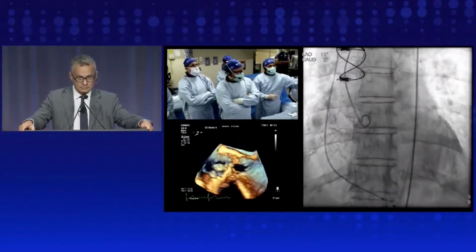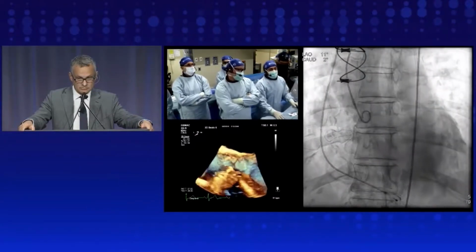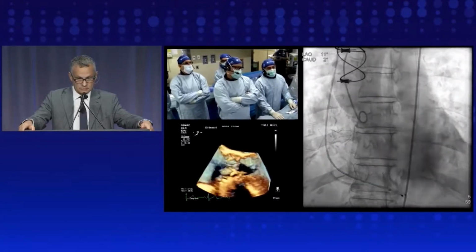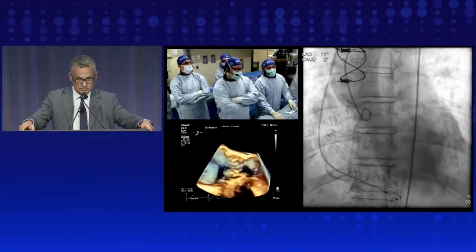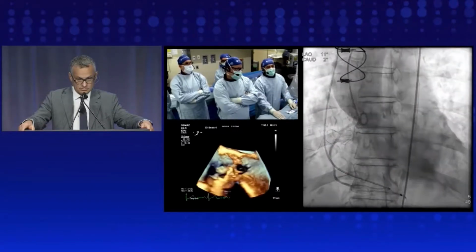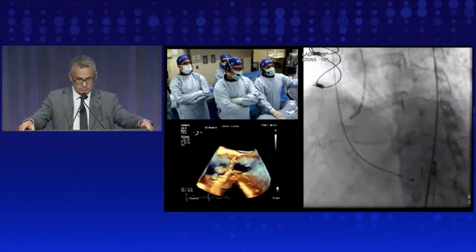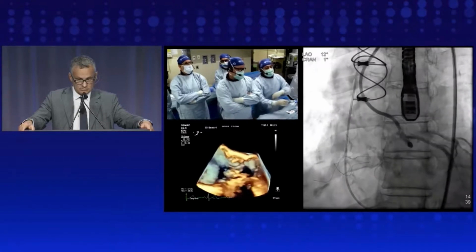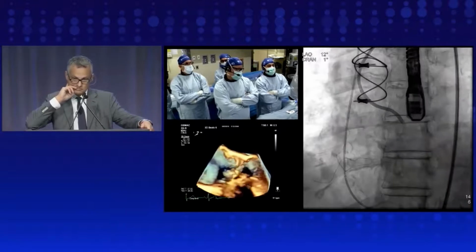Okay. So basically, we talked about PCI and Sentinel, but this is our target for treatment. We have the Freestyle 25, severely regurgitant, as you can see. You can see even the leaflet of the left cusp, how it comes up, and if it were deflected, it would occlude the left main. Here is, go forward a bit. More selective injection into the left cusp, and you can appreciate the danger of that stentless valve.